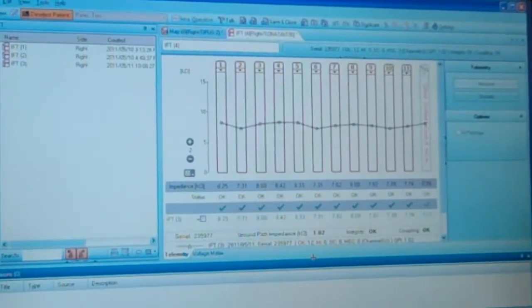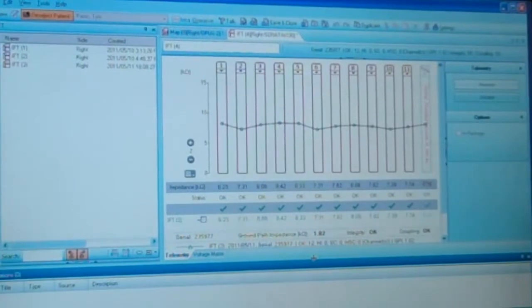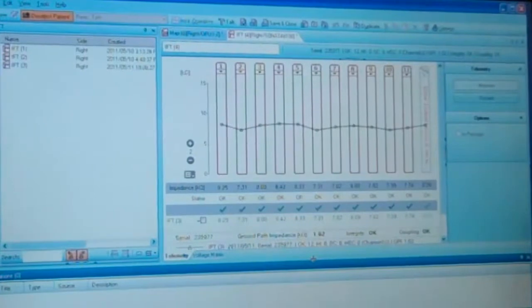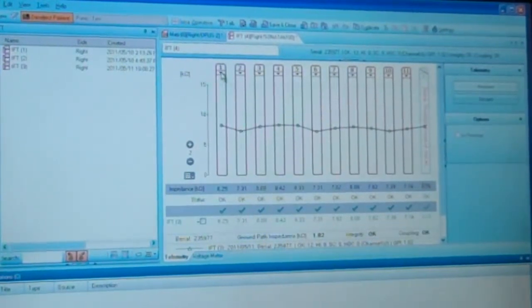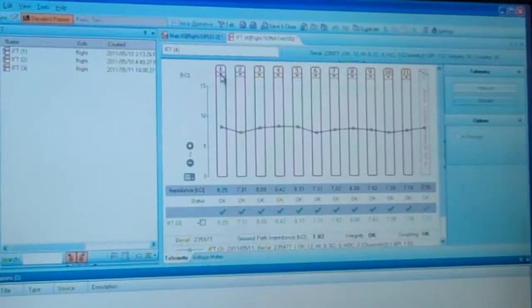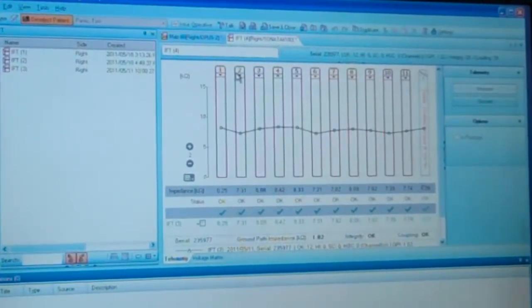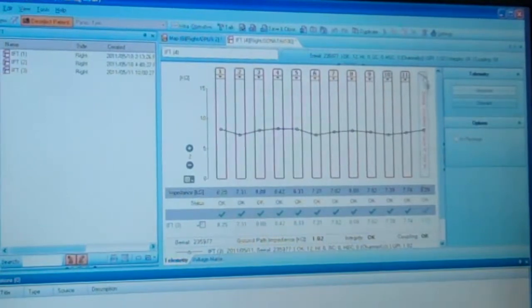Once we have the device hooked up to the programming software and placed on the patient's head, we do two things. First, we take a measurement of the internal piece to make sure it's functioning properly. This device has 12 electrodes — some have 16 and some have 22 — that we program. We take a measurement of each electrode to make sure it's functioning and that we can use it. You can see on this one that electrode number 12 was not working properly, so we've shut it off.